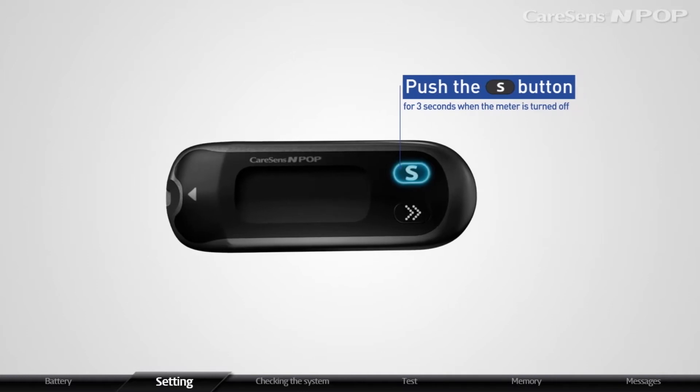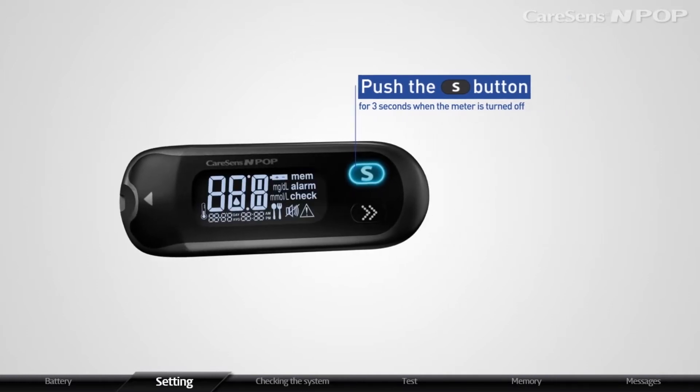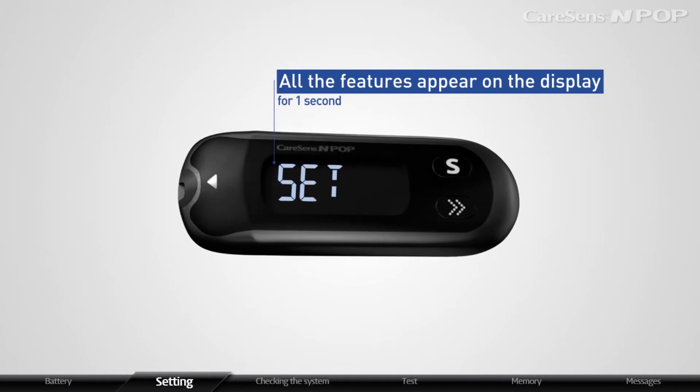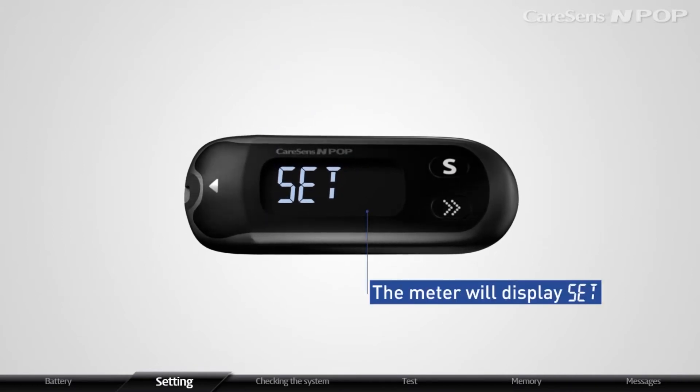Push the S button for 3 seconds when the meter is turned off. After all the features appear on the display for 1 second, the meter will display Set.